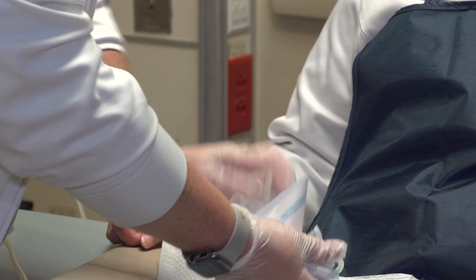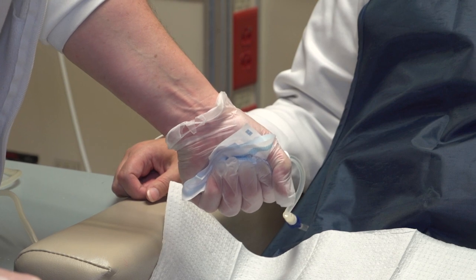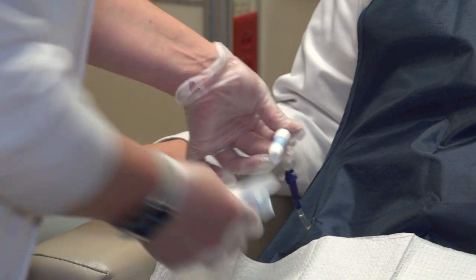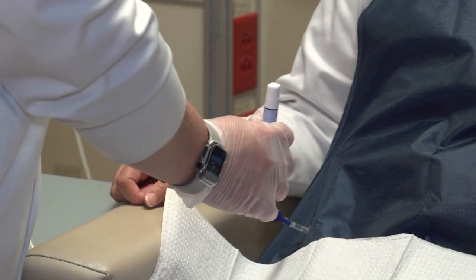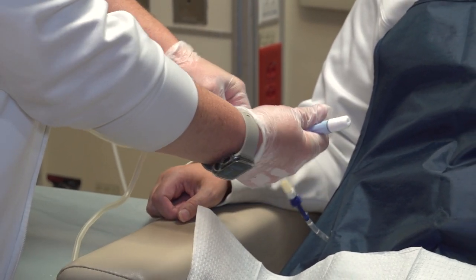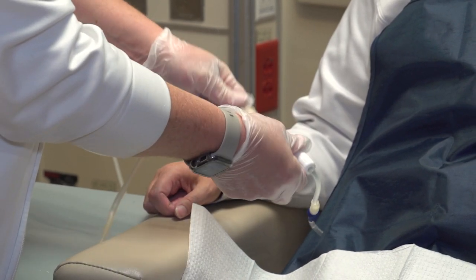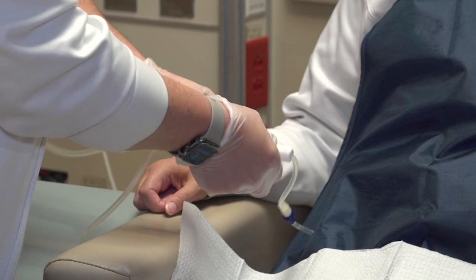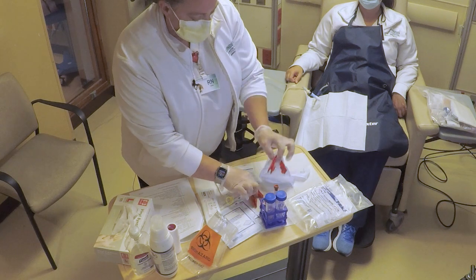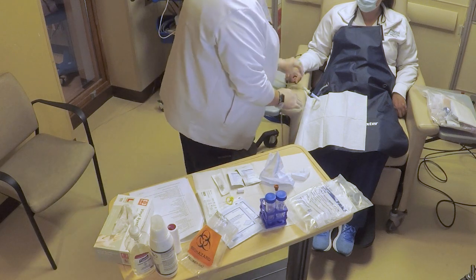We want the bleach solution to get in those crevices. We hold this, let it soak for 1 minute. Once that 1 minute is up, we remove our cap from the ultra bag, the mini cap, keeping both ends sterile. You'll need 2 ultra clamps, which are these red ones. You'll put one on your fill line and one on your drain line.